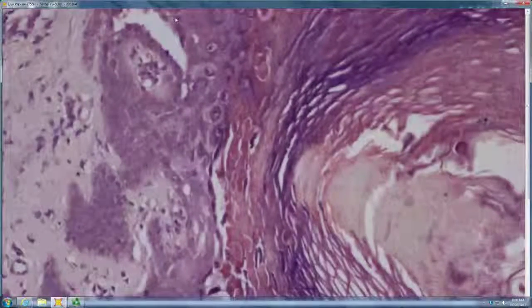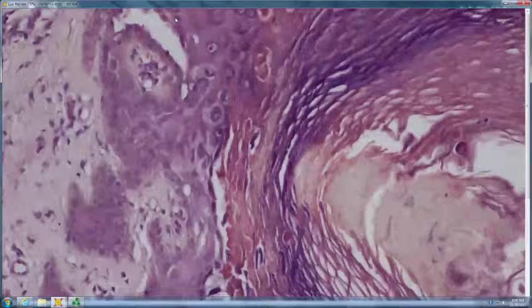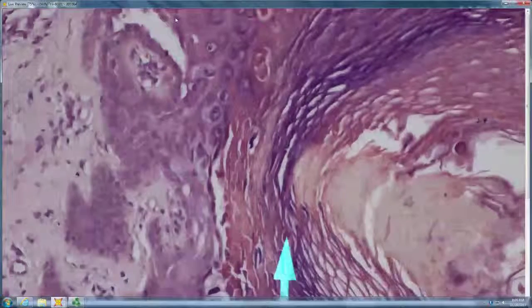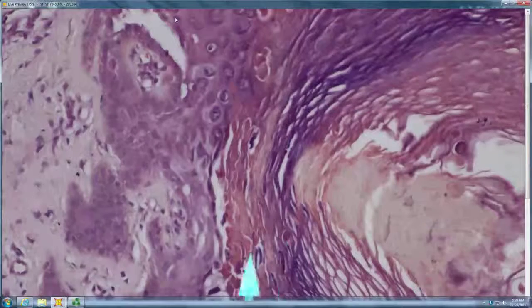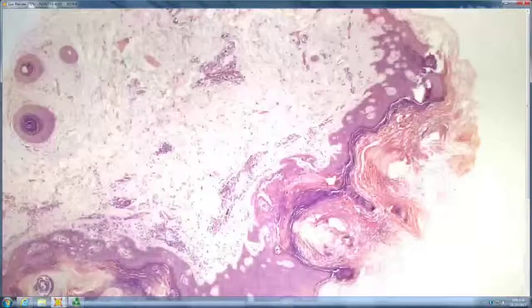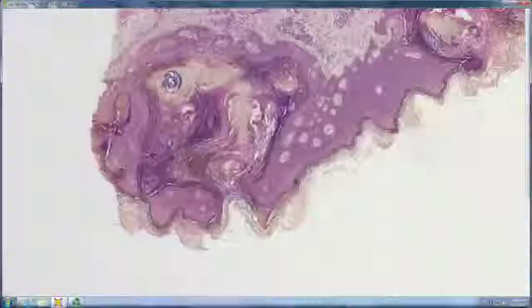Yeah. So one of the clues to EHK is you always have a very compact corneum. Okay. This one's more basket weave, and you can see some of the dyskeratotic corps ronds spitting out. There are lots of corps ronds present. If this were a solitary lesion, it could be a warty dyskeratoma.